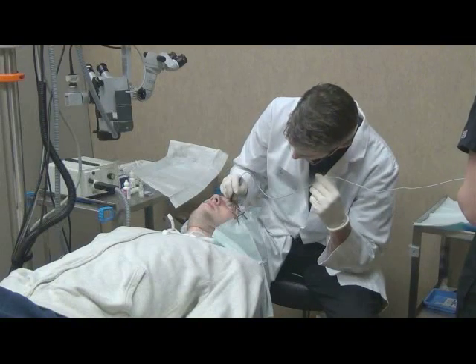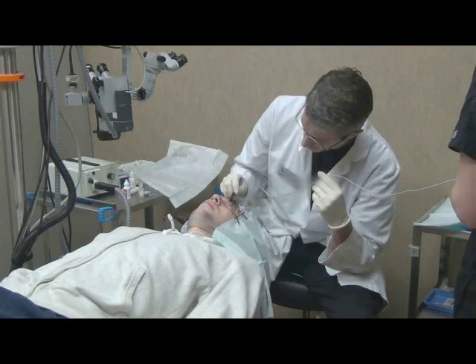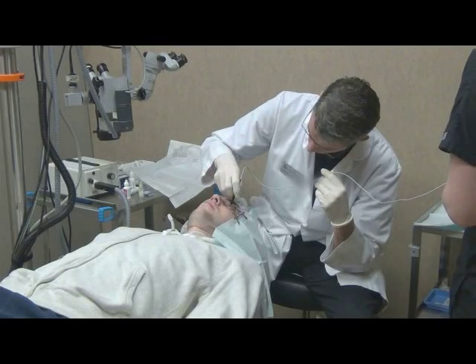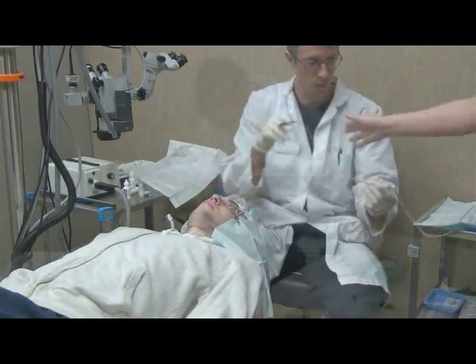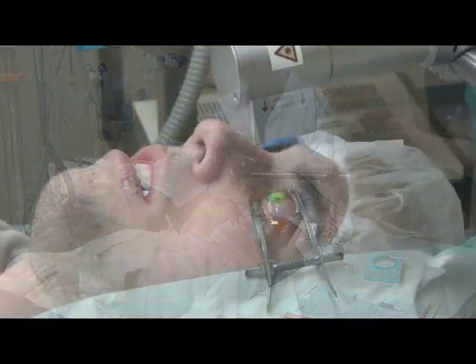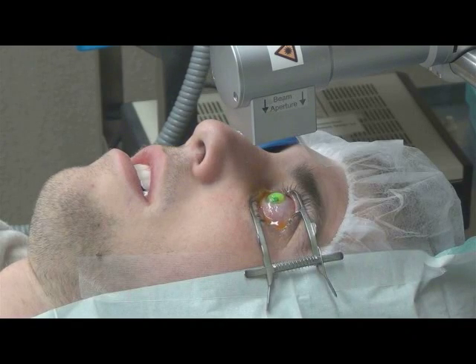Next we'll bring the patient back, recheck the thickness to make sure it's appropriate for the treatment, and then we'll line up the ultraviolet light and shine it on the cornea for a fixed amount of time. The amount of time we shine the light on the cornea depends upon what the intensity of the light source is.